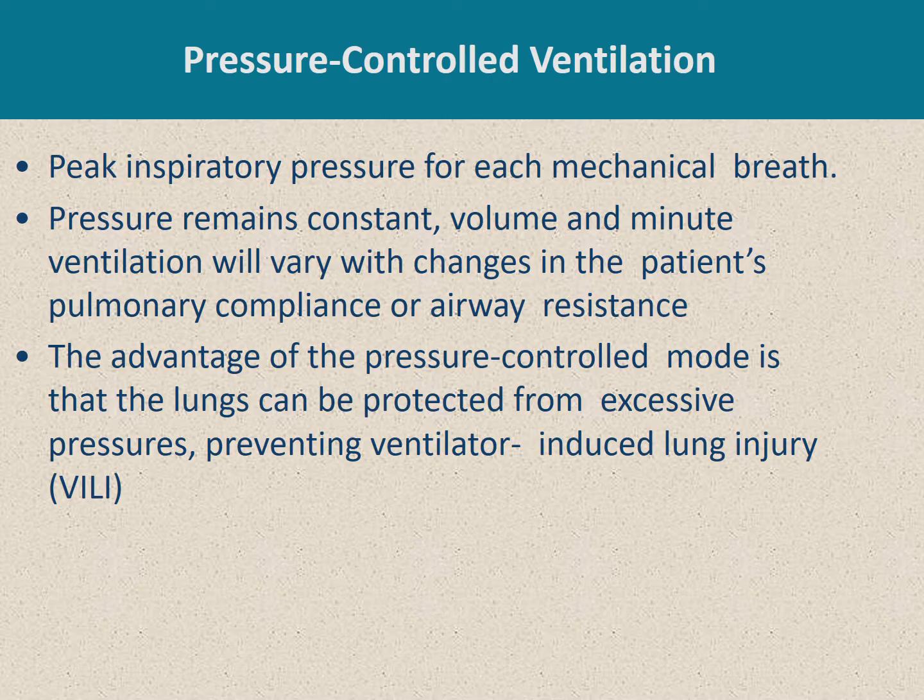Its advantage is that it produces a little less airway pressure, mean airway pressure, that may protect the lung from excessive pressures and prevent ventilator-induced lung injury.